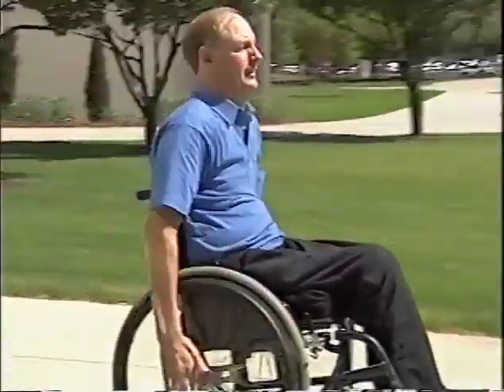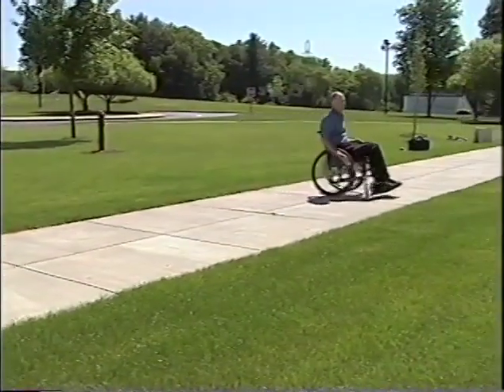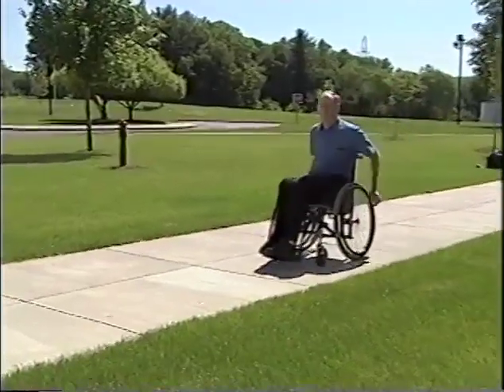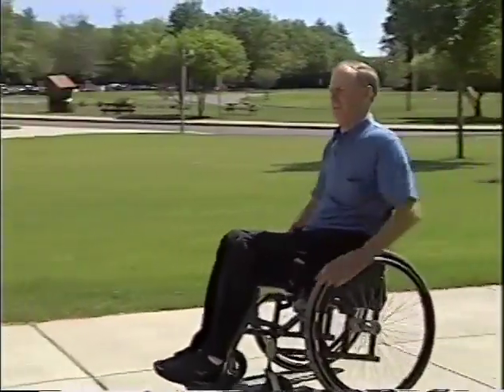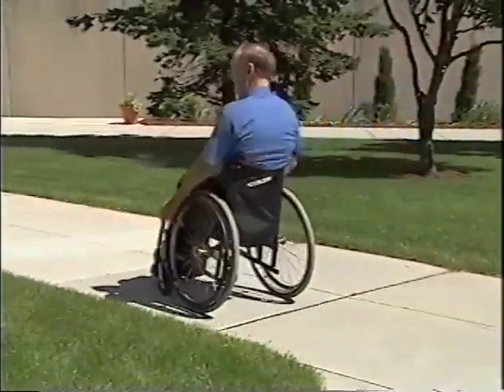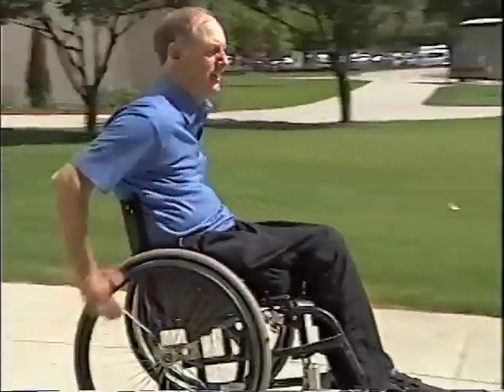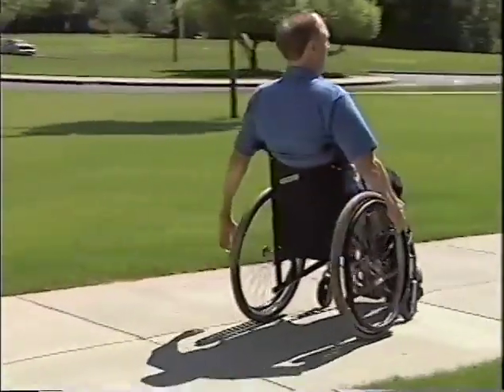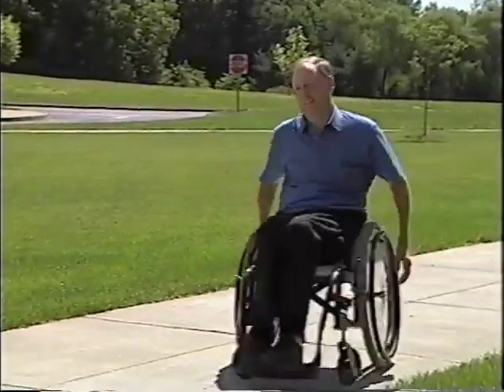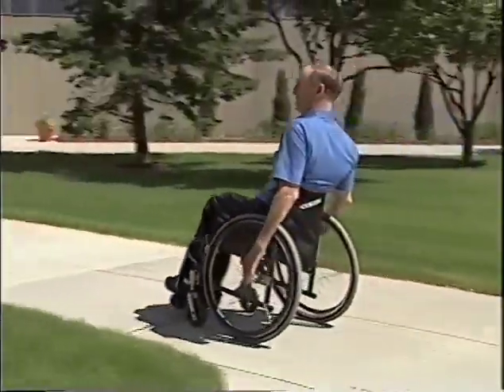Just start out nice and easy. The one thing you don't want to see, and it's very diagnostic, is people that wheel like this. You'll see this in a lot of nursing homes. It's very inefficient. So make sure you get out of that habit and just get into rolling your hand around nice and easy. And stay back and let the chair carry your weight.